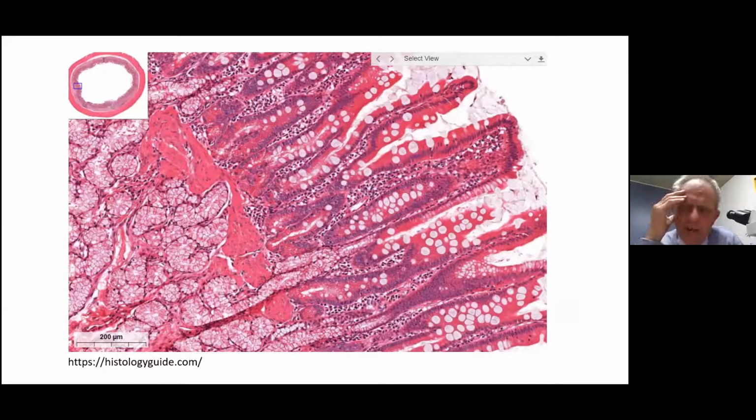If you don't do that, your chances of getting orientation like this are extremely limited, in fact impossible. So we have to make do with what we get, and I think it's relatively easy to assess whether you've got atrophy or not. And of course, the other thing is to take into account the clinical features.